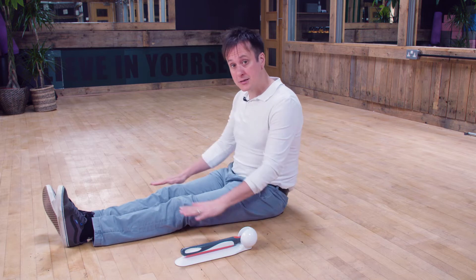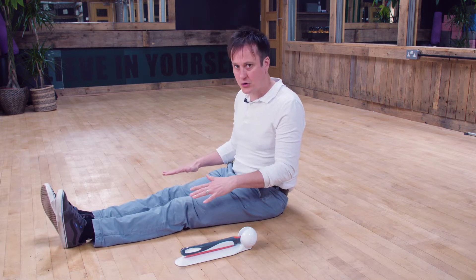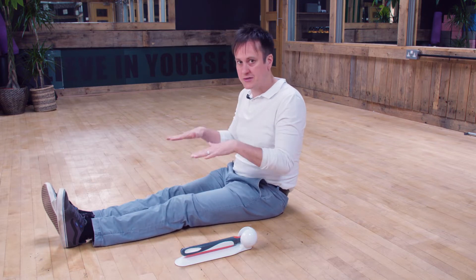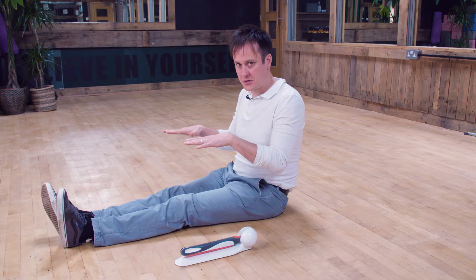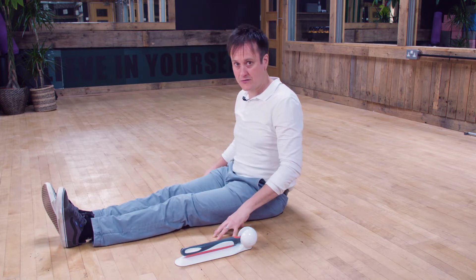You need to be sat on a hard surface, so ideally the floor. If you struggle getting on the floor, you can put a board on a bed. I wouldn't recommend using it straight onto a mattress because the mattress will be too soft, so the board makes it hard, but ideally use it on the hard floor.